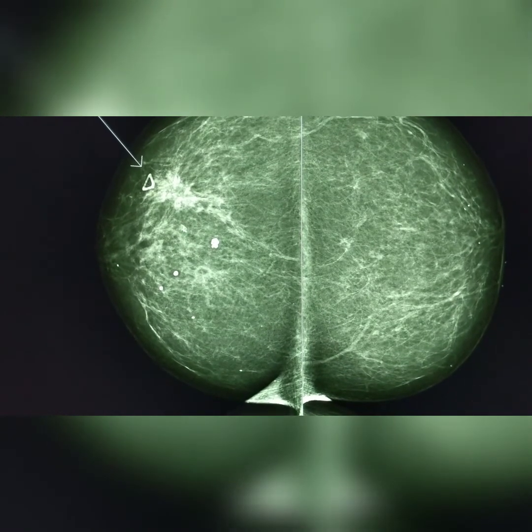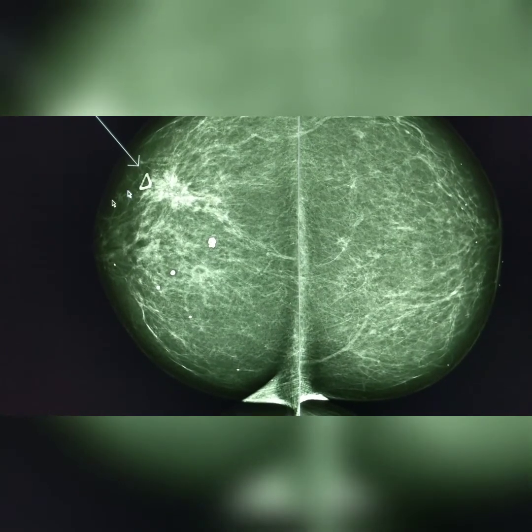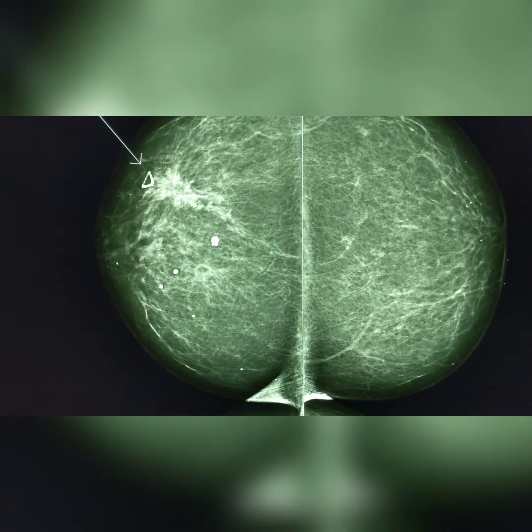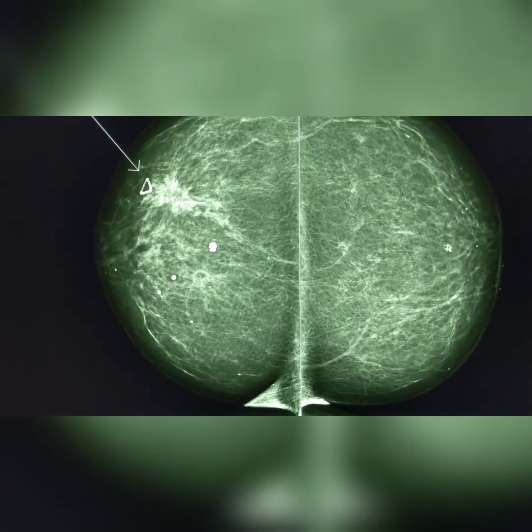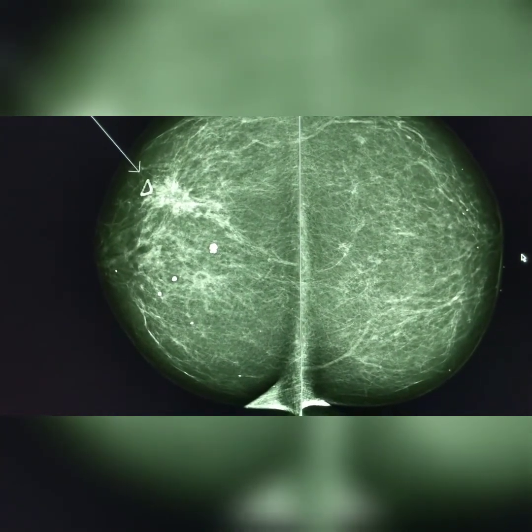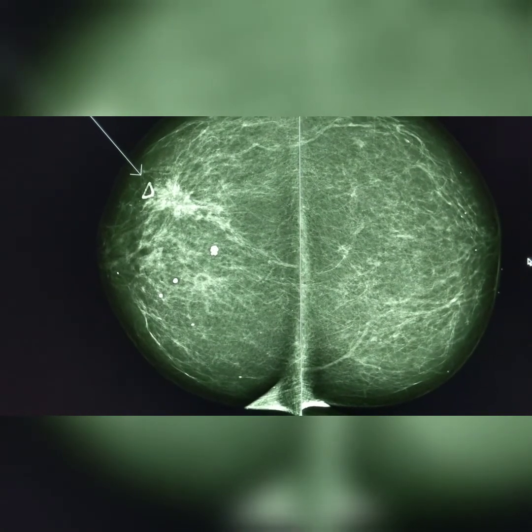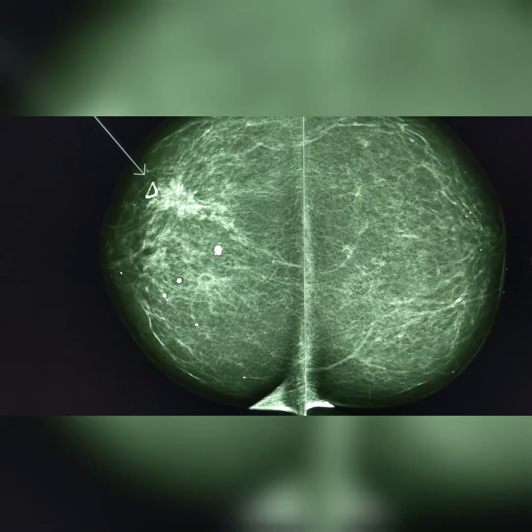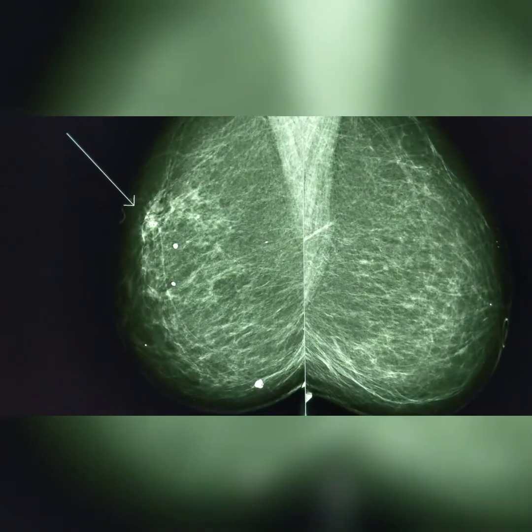Coming in a slightly different configuration, you could have this kind of thing seen on both sides, not as star-like or stellate or spiculated looking as this. And it could just be normal breast tissue in a woman. So sometimes that can create difficulty. You're wondering, okay, is this just normal tissue or is it actually a developing cancer? So you want to be careful with that. And that's part of why we do so much training and we see thousands of these cases every year that are normal. So it helps us pick out the abnormal.